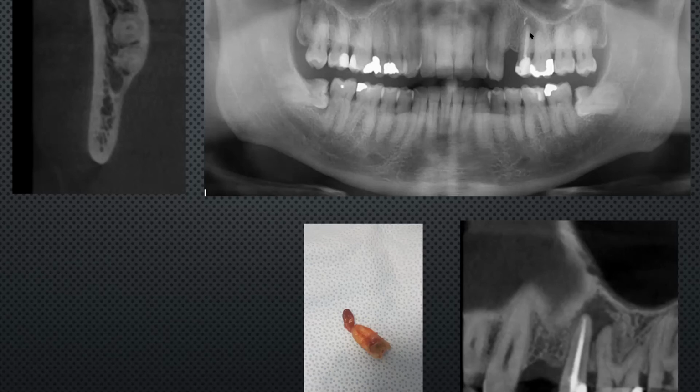Yeah. It's interesting, because some people prefer to hand torque it in at the end. What made you decide to do it this way? Is it just from your own personal experience? Well, not really. I think I just get very nervous. People talk about early crestal bone loss, or implant failure within the first 2 or 3 weeks. I mean, that's never happened to me, not yet, touch wood.